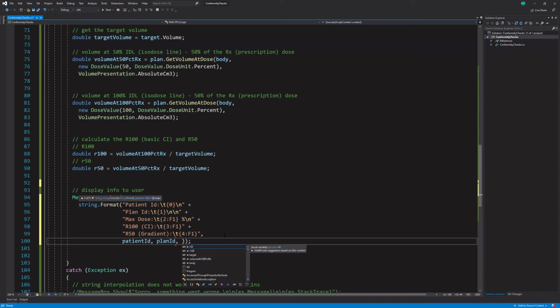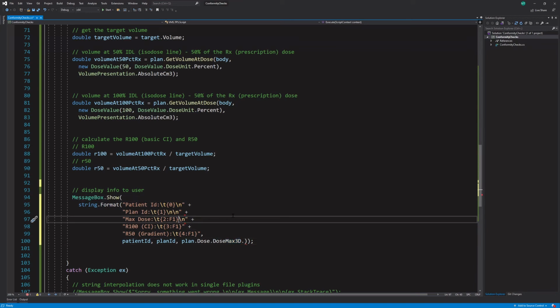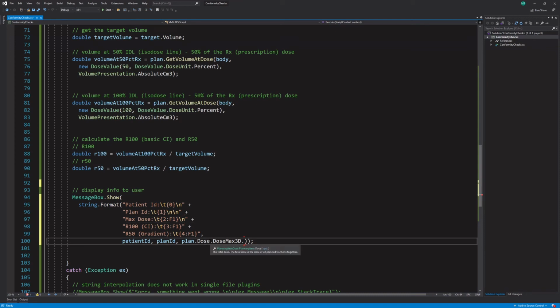We haven't actually gotten the max dose yet, so let's do plan.dose dose max 3D dot, and we want it in percentage. So actually, instead of doing this, let's just give it the max dose. Let's see, plan.dose. I don't want to have to set it. Because what you can do is explicitly tell it what you want the dose unit to be in. Plan.dose dot, let's see.